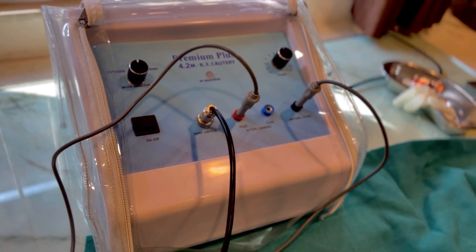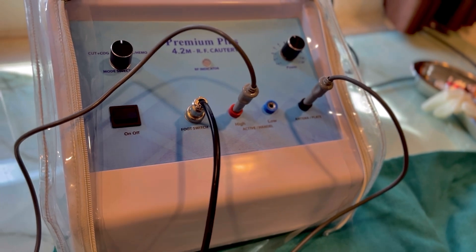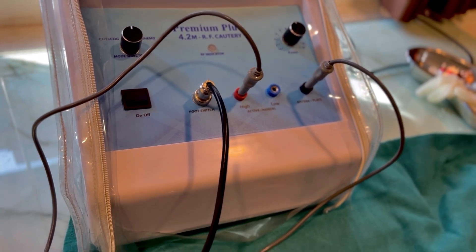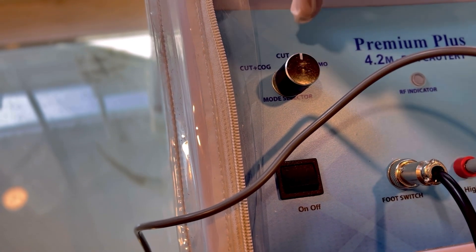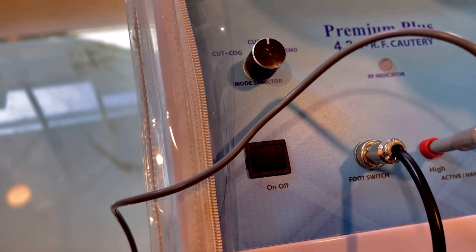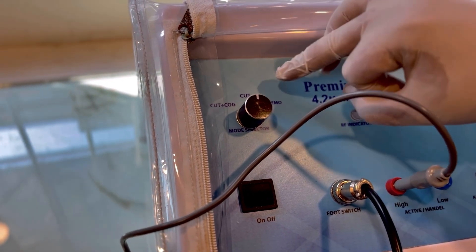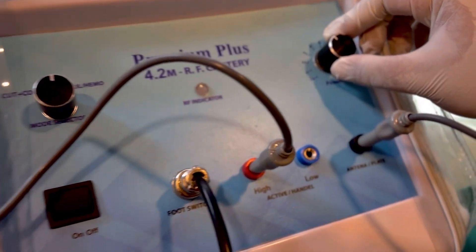There are two types of cautery: bipolar or unipolar. We have the unipolar cautery here. A bipolar cautery is always better, but we can work with unipolar as well. The unit has certain modes: cut and coagulation mode, cut mode, and hemostat mode. For cauterization we usually use the cut mode — yes, you heard it right, the cut mode only — and try at the minimum possible power.